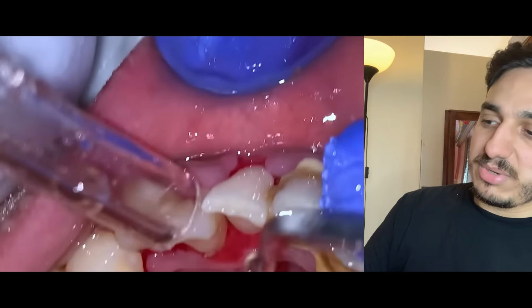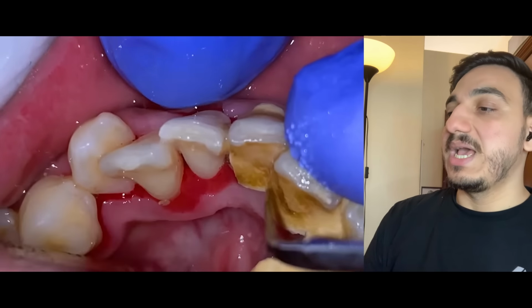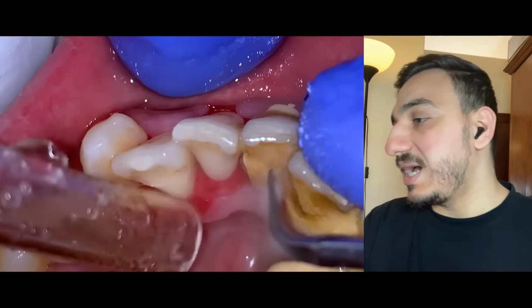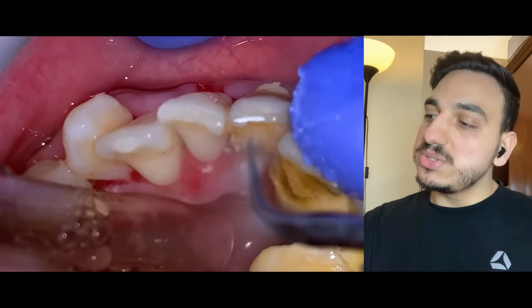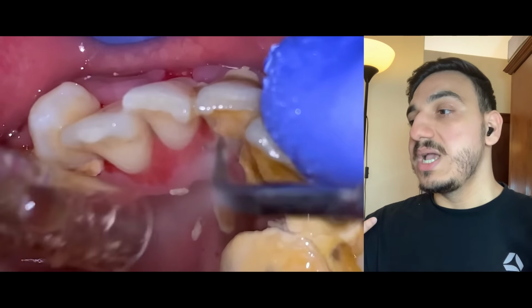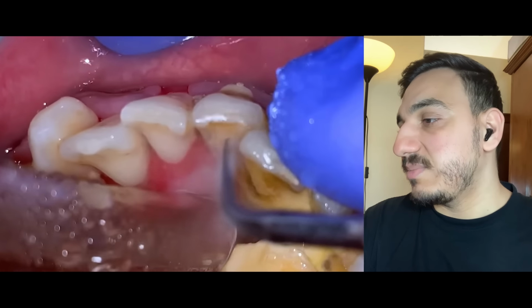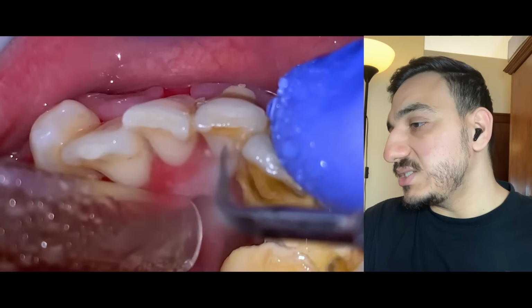As I said, that particular fine tip is really helpful in getting to the fine areas in between the teeth as well. The operator chooses to break these huge pieces of dental tartar and dental calculus into smaller pieces to make it easier for the dental cleaning procedure as well, doing a really great job so far.